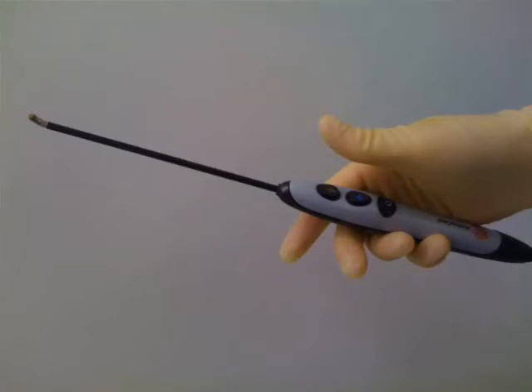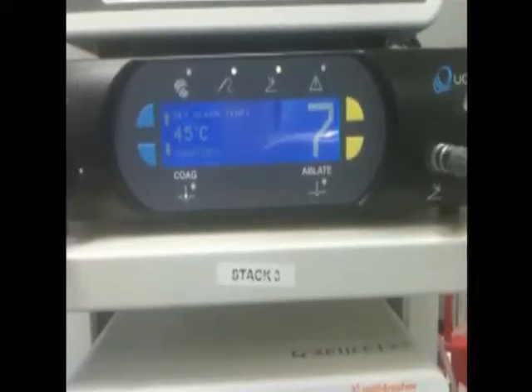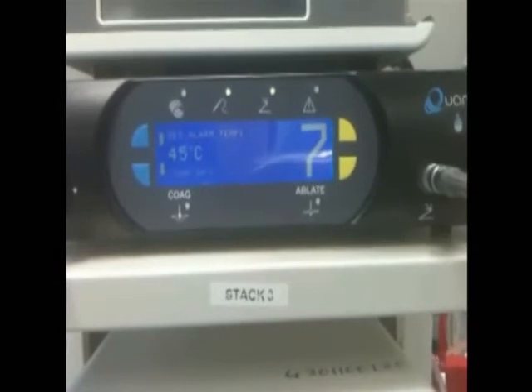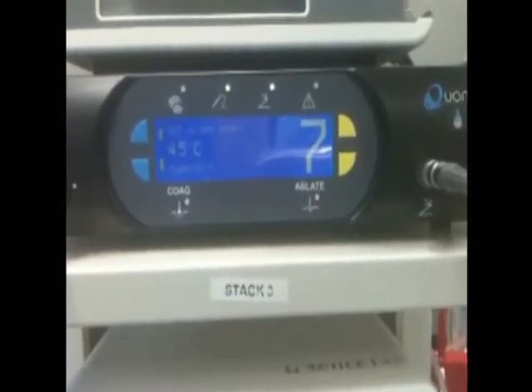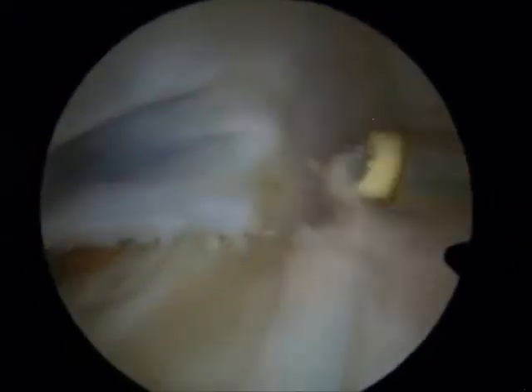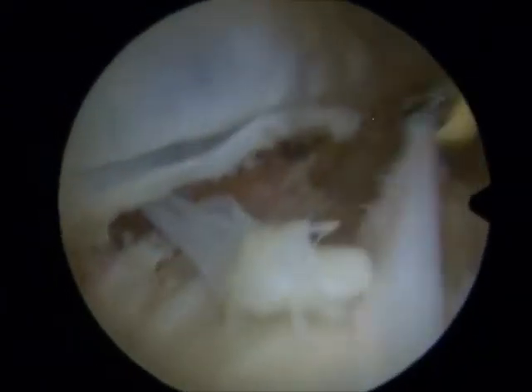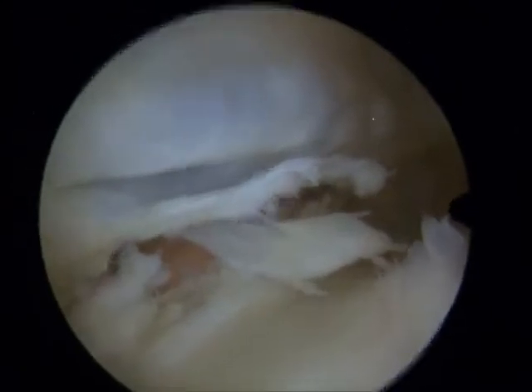There it is — the new wand. It's got a thermocouple at the tip, so we know exactly what the temperature is at the tip. You can see when I'm using it, the temperature never goes above body temperature. I've got it set to 45 degrees, so there are alarms if it gets hot within the joint or at the tip of the probe — it never does that. This radiofrequency kit is very, very easy to control the temperature at the tip of the wand. It's been great using the new Ambient SupraMultivac because it just reassures me that that radiofrequency tip isn't getting too hot.